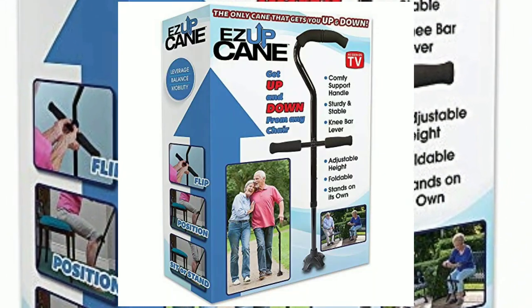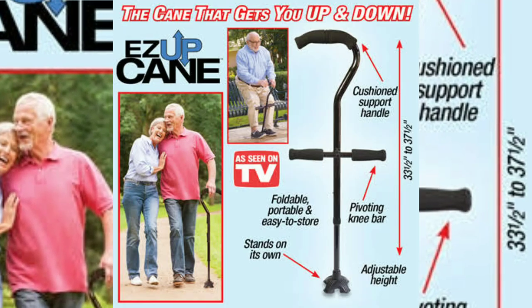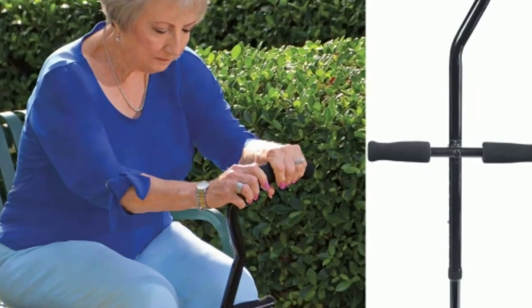Hello friends, today I am going to show you a product which is very useful for your safety. Let's see what this product is and how you can use it.